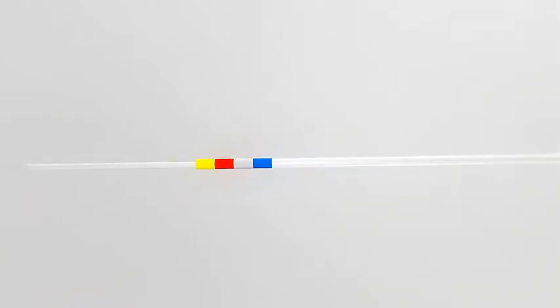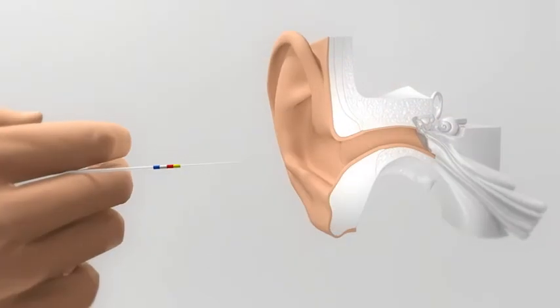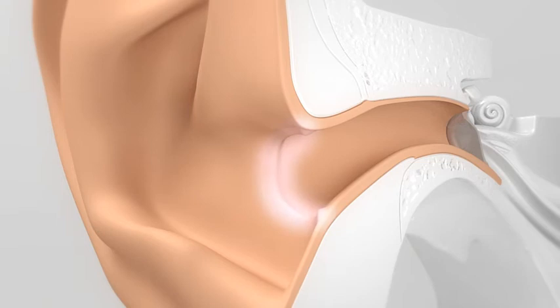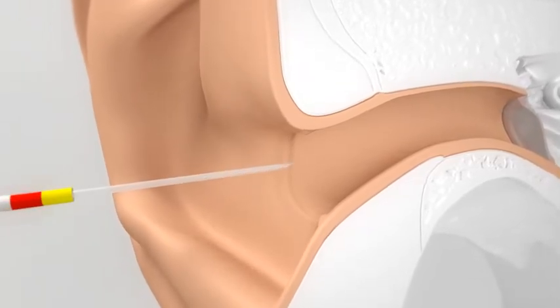Begin the sizing procedure with a length sizer. The length sizer has a soft, probe tube-like tip, color band markings, a shaft, and a handle. To measure, hold the shaft of the length sizer between your index and middle finger. Locate the posterior meatus. This will be your reference point for the sizing and fitting process. Insert the length sizer in the ear canal and allow the tip to rest on the canal floor.